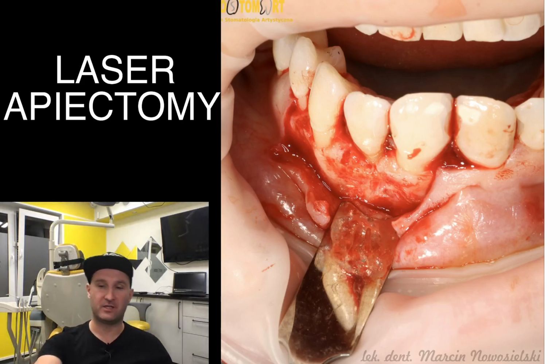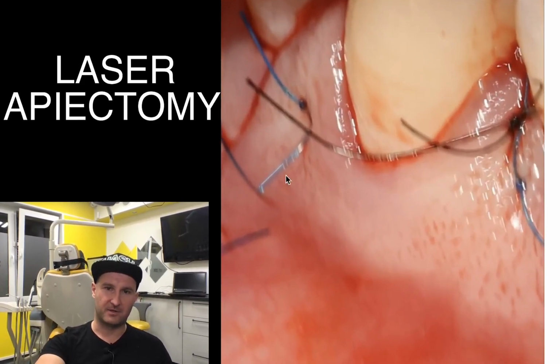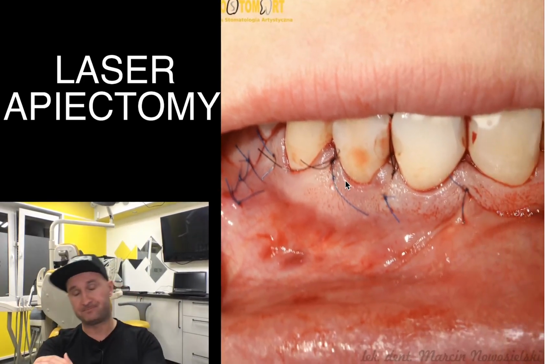And after that we performed suturing of the operated area. As you can see, we sutured the papillae with vertical mattress sutures, and the vertical incision with simple interrupted sutures, and that's it. It took a couple of minutes.